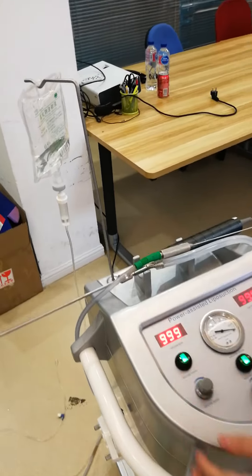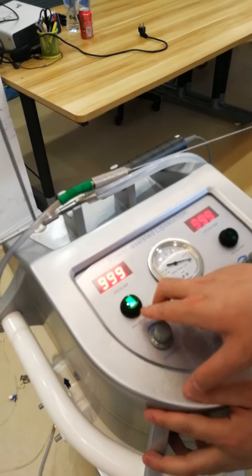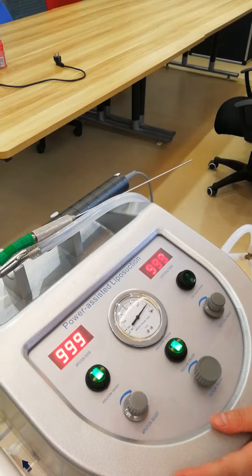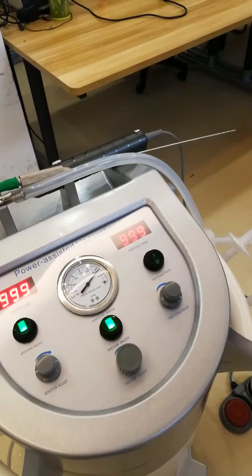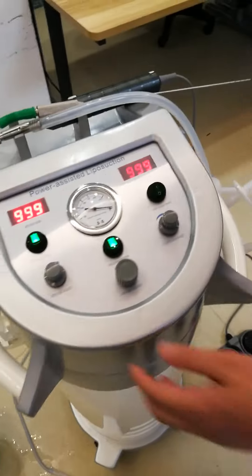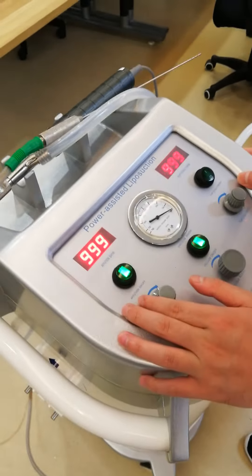And the second, you can adjust the suction power in here. And the handpiece is by this part. It's not the same.